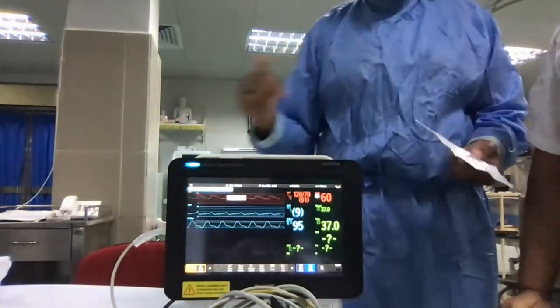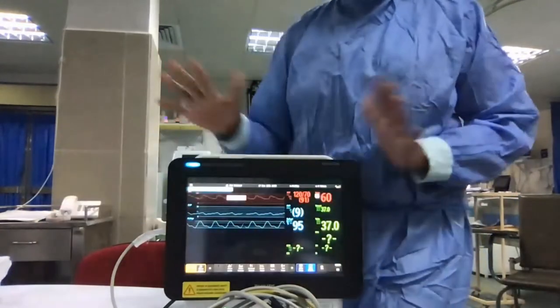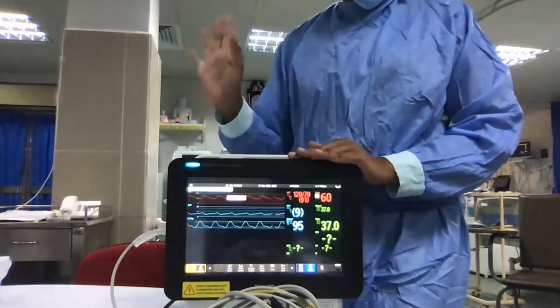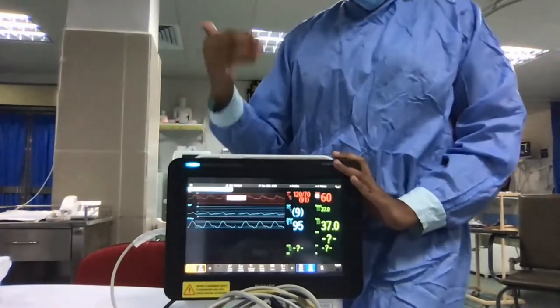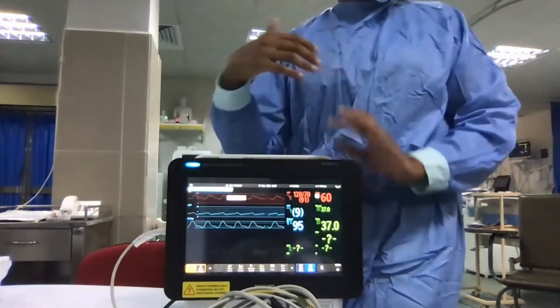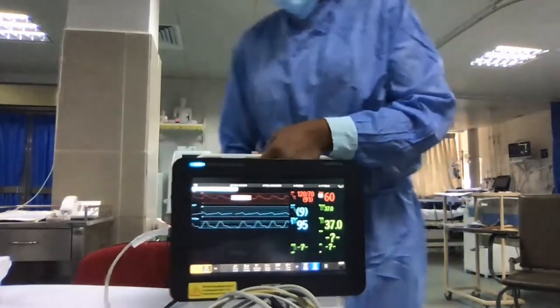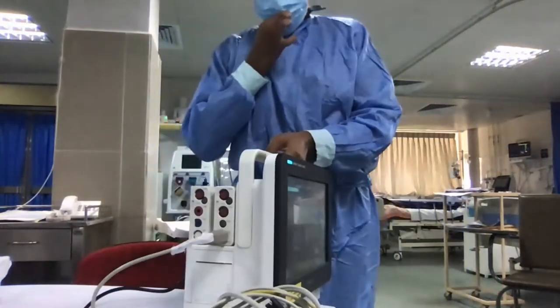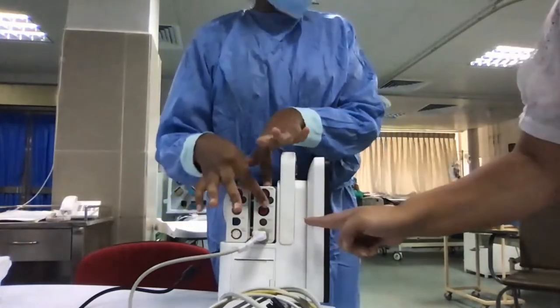Like madam told you, what we need for this procedure is a Philips monitor or someone else's. Anyway, we are the authorized person for PiCCO monitoring, so whoever is monitoring PiCCO has to order everything through us. So the PiCCO monitor, then you need to have a cardiac output module. Actually, this is the cardiac output extension.